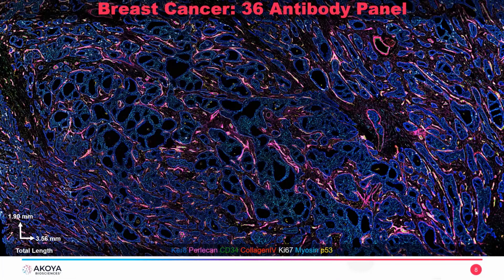For those of you who don't know, there are certain types of epithelia in here, and they will be the topic of today's discussion. What you can see here, for example, are secretory epithelia. This big area. Each one of these round circles is a secretory epithelium. We also call them lobules. These are the areas of the breast tissue that produce lactation fluids. In this case, this is breast cancer tissue. I should emphasize this is a stage 2 ductal adenocarcinoma.